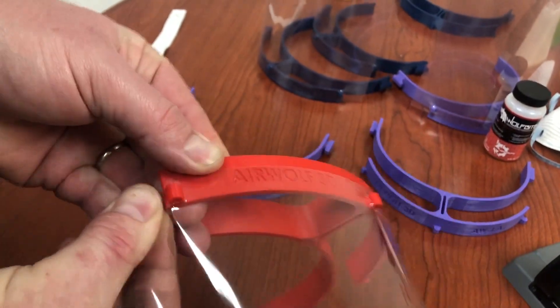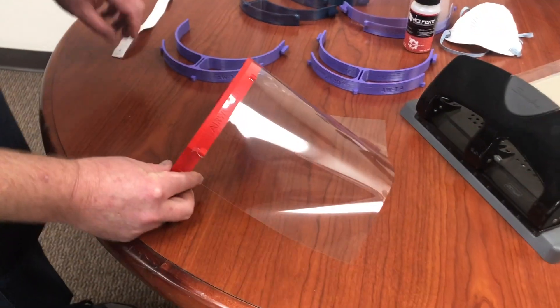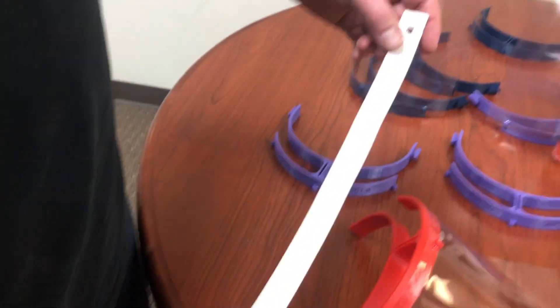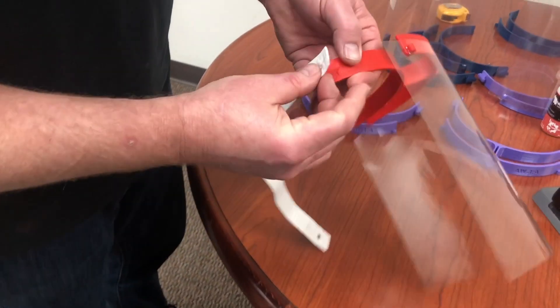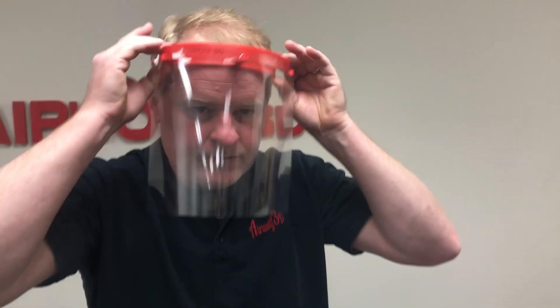The device also has little ridges in the back to hold the transparencies nice and strong. We took an elastic strap and cut it to 16 inches long, and we're going to put the elastic strap on our face shield. In about a minute or less, we have a functional, probably light duty face shield.